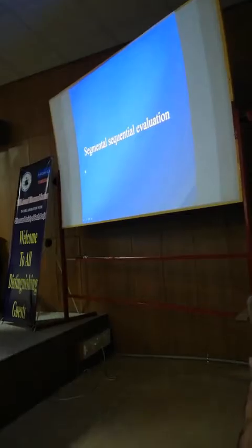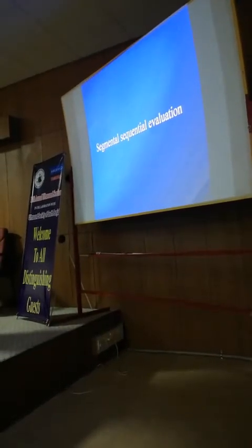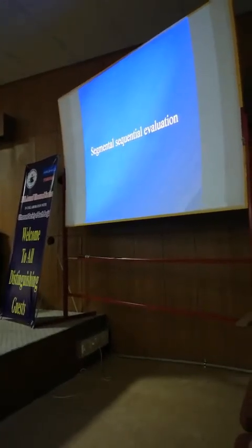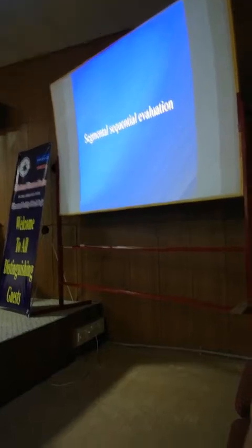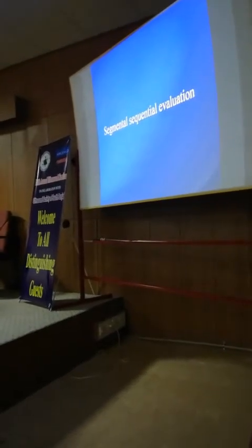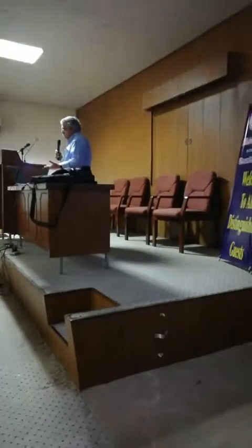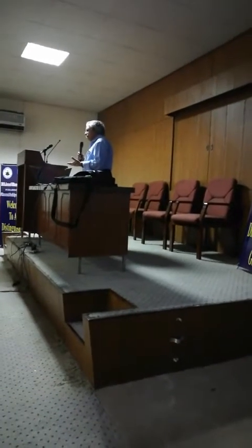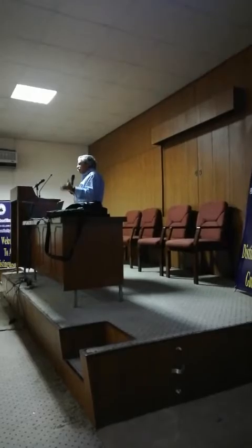Okay, now what we have done is a basic cardiac exam. We have done an extended basic cardiac exam. If you are a cardiologist, they're reporting something which is called segmental sequential analysis. This is more or less the same things that we've already done. They've looked at the great vessels, they've looked at the four chambers, they've looked at the outflow tracts.